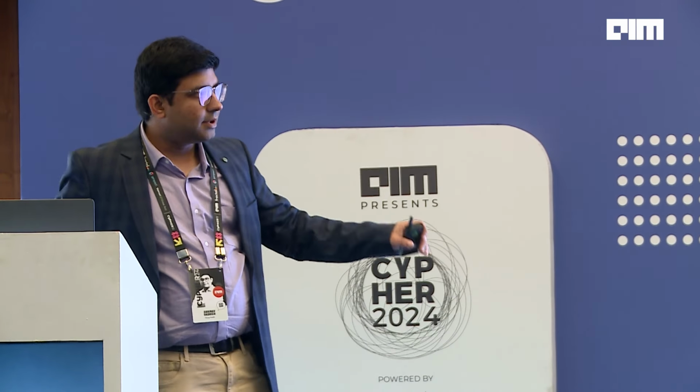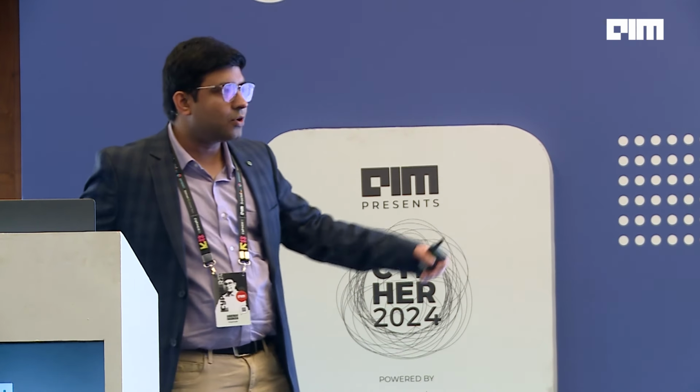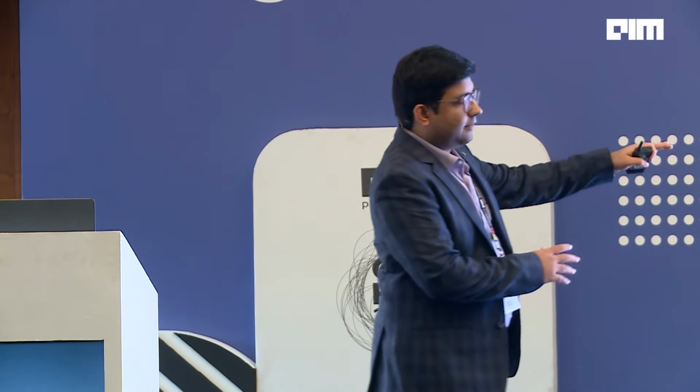This has about 80% of the data, which is about 18K in the training set. Luckily I've got this. In real life, for specific classes, I don't always get 18K samples. So the task was done to evaluate what happens if I don't have 18K. What if I have only 50% of the training data set? How much does the performance change with the foundation model? There is a minor drop in performance even with half the training data. But if I reduce to 25%, which is about 4 or 5K, then there is a drastic change, and that's where the performance starts decreasing.